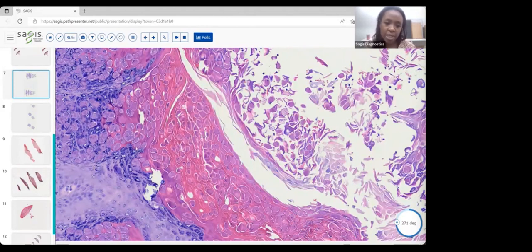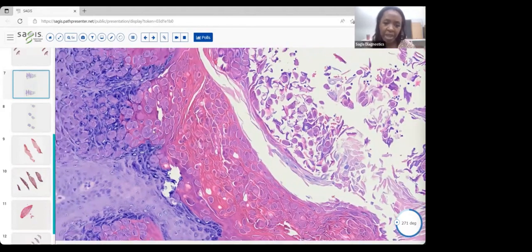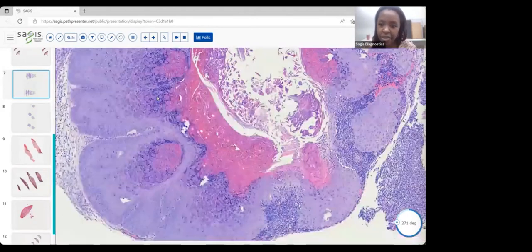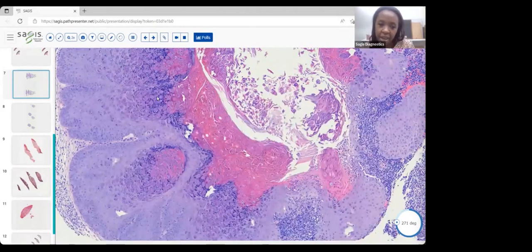As we go deeper into the granular layer, there is some basophilic breakdown around these inclusions. So that's something that we characteristically see in this particular diagnosis. You know, densely eosinophilic areas adjacent to strikingly basophilic ones. So this color pattern is very typical. This is molluscum.